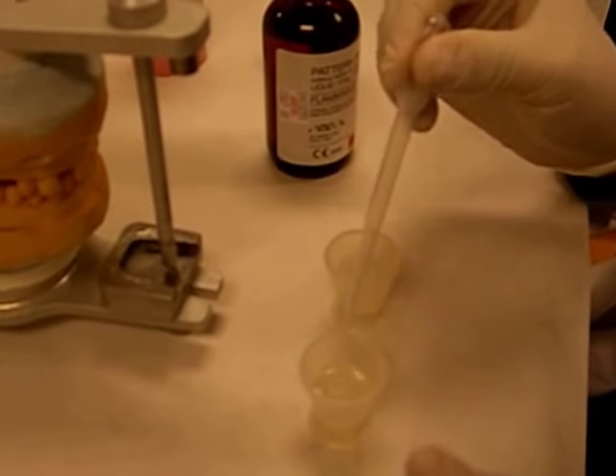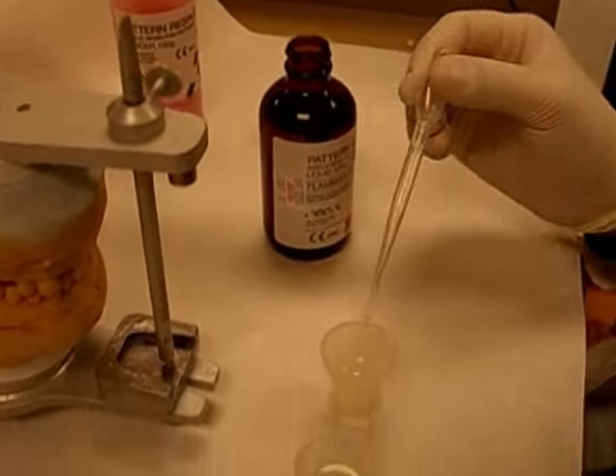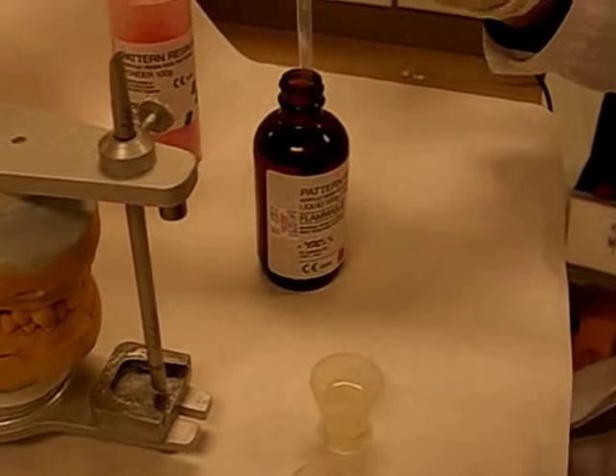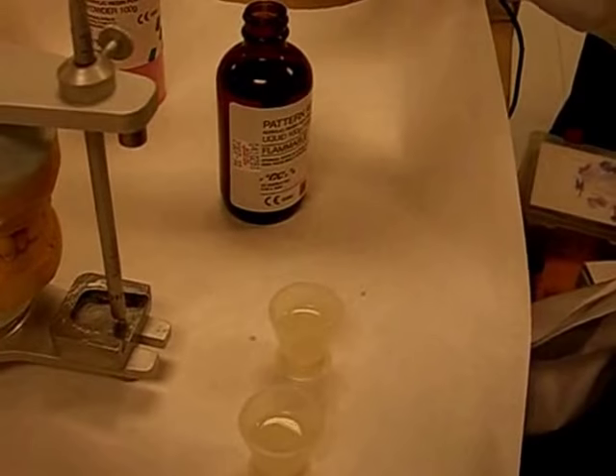Always incorporate powder into liquid. You need a spatula. Can I have a spatula, please?